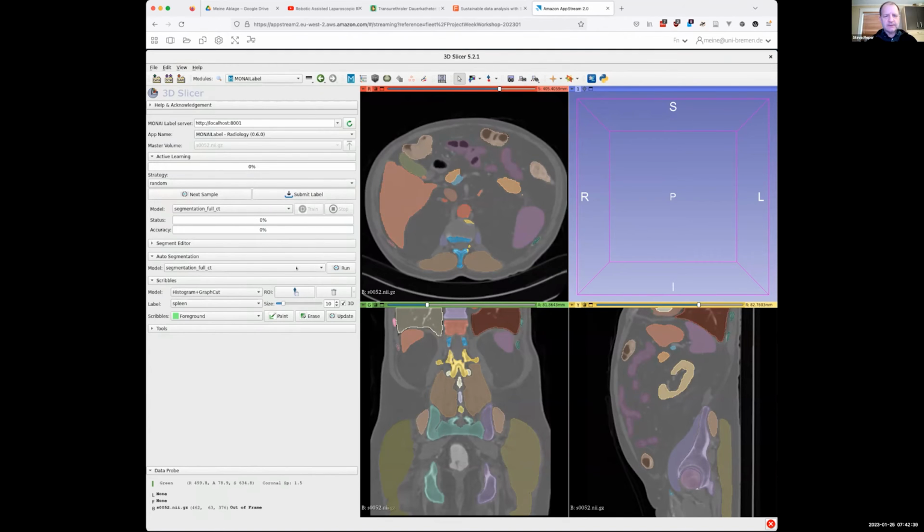Yeah, that's interesting. Well, one thing you can do is maybe just try restarting it. It looks like it may have gotten into a... Yeah, somehow I don't know if I can even close it, because the close button also doesn't work. Could you try to just refresh the page? If you move your cursor to the URL tab, just hit enter. Actually, I can't see there.